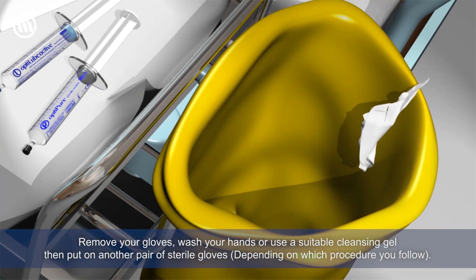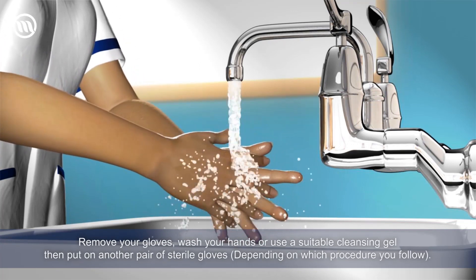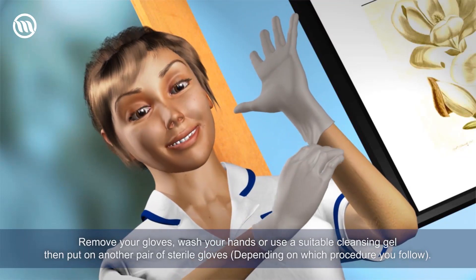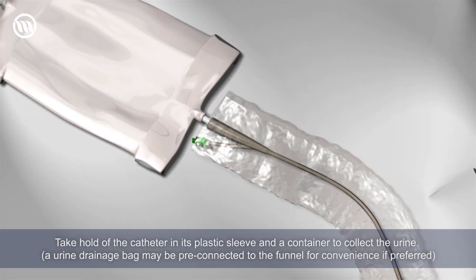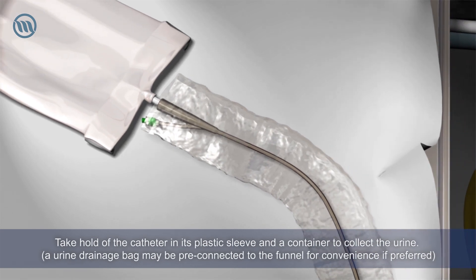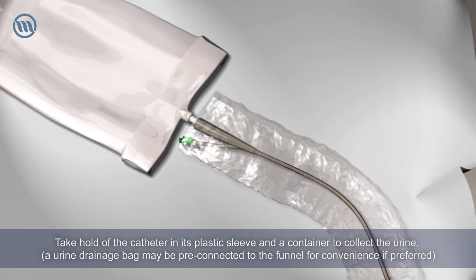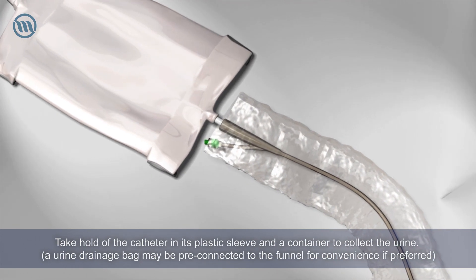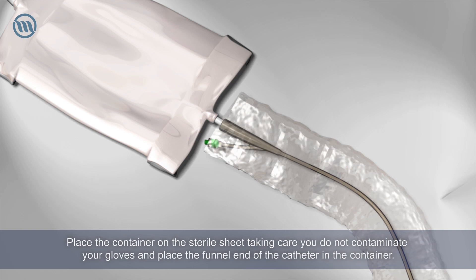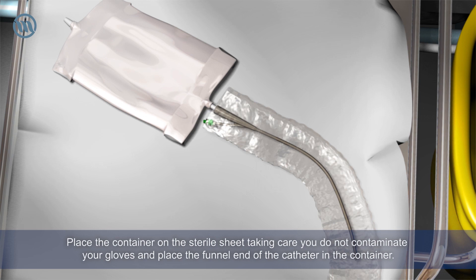Remove the gloves, wash your hands or use a suitable cleansing gel, then put on another pair of sterile gloves depending on which procedure you follow. Take hold of the catheter in its plastic sleeve and a container to collect the urine. A urine drainage bag may be pre-connected to the funnel for convenience if preferred. Place the container on the sterile sheet, taking care you do not contaminate your gloves, and place the funnel end of the catheter in the container.